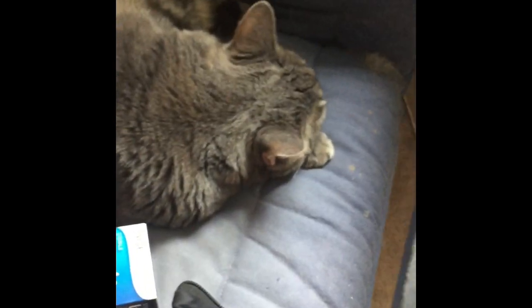Hi, my name is Janet and this is my cat Cece. Say hi, Ce. And we're going to show you really how simple it is to test your cat's blood sugar in her ears.